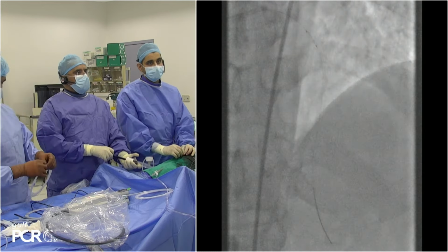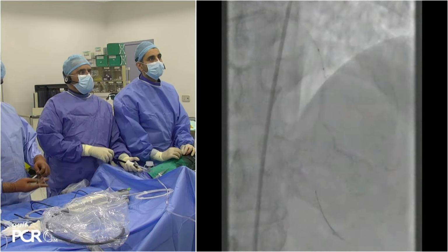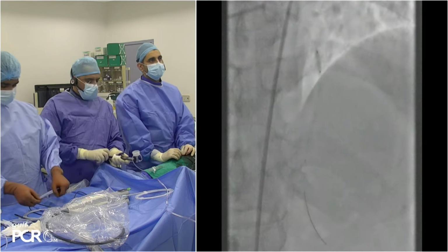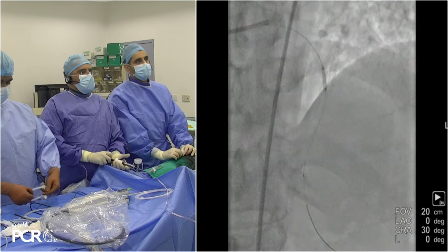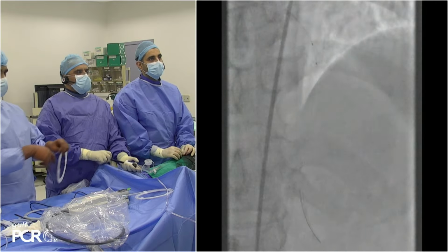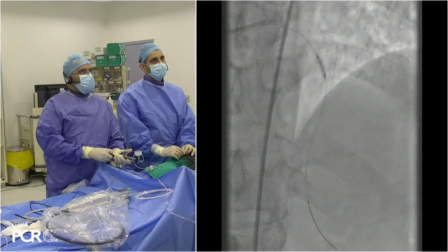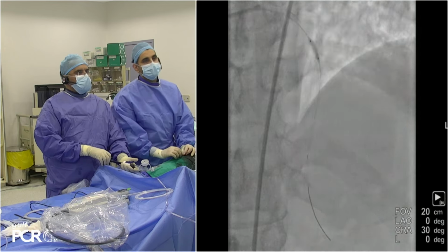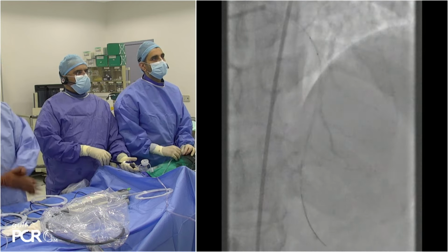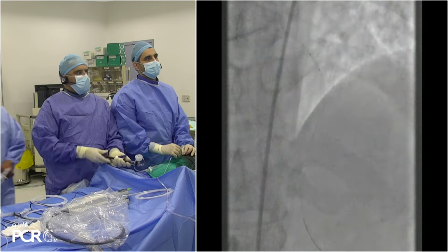But you show us the angiographic control. And what do you think about the image you obtained after orbital atherectomy in proximal LAD? You can see it's more hazy. Let's go back. I don't know if I got your point. I think you're asking what do we expect to see on the OCT after the orbital? Yeah, it was just your interpretation of the angiography image post-orbital atherectomy. From here, we cannot see any improvement of the image. Could be the opposite.